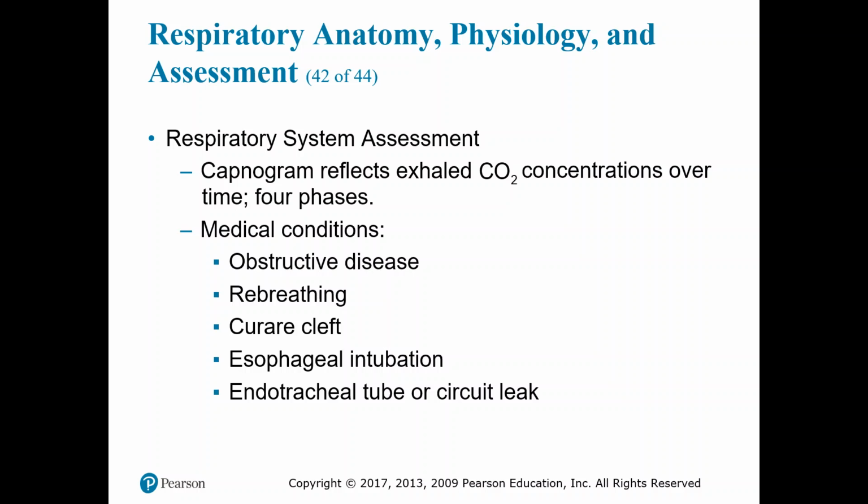And the flip side of that, for hypoventilation, you'll see an increase in CO2 retention and progressive elevation of exhaled CO2 levels. So your waveform is going to become bigger and larger, and it's going to exceed the 35 to 45 range that we're shooting for.